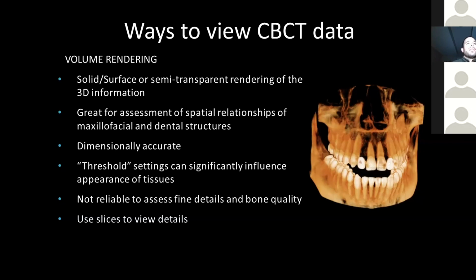If you're doing something else like planning an implant, of course, the implant site and any proposed graft harvest sites or other surgical sites are really important to note. So basically that field of view, whether you're doing a guided surgery or not, or have any specific requirements based on your protocol, you can also put in, for example, if you need to be imaging at 0.2 resolution versus 0.3, all those decisions might be relevant.